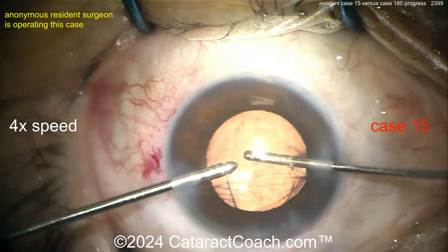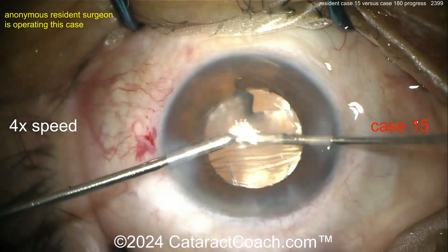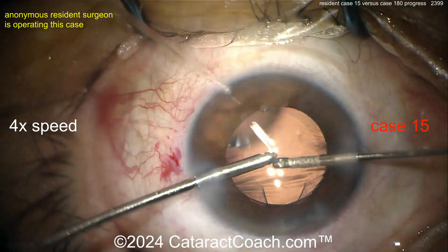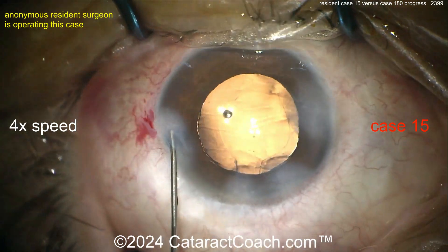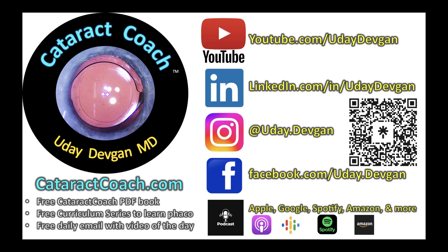For case 15, I would not go behind the posterior surface of the optic — don't worry about it. Take out the viscoelastic from the anterior chamber and don't manipulate too much — just get out of there. Seal up the incision. We don't like to seal that way — we like to do the roof of the incision. Remember the roof: you only did the two sides of the incision, not the center. Now let's watch the other case. If you're a resident, check out CataractCoach.com — download that free book. There's a full curriculum series, all free.